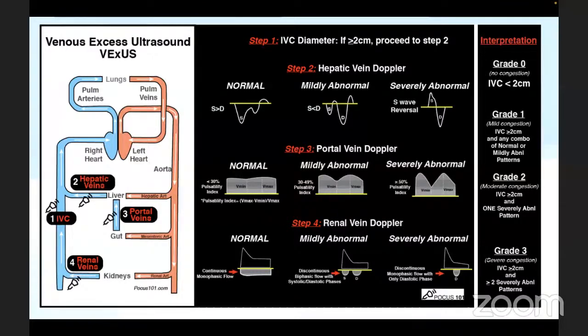If it is not possible in the subxiphoid position, then you go for the mid-axillary line. In the mid-axillary line, you should be able to appreciate it laterally, in the right subhepatic area. Because sometimes even I am not able to see the IVC, in those cases I usually go for the mid-axillary line in the coronal plane and I go for the quantification of the IVC.